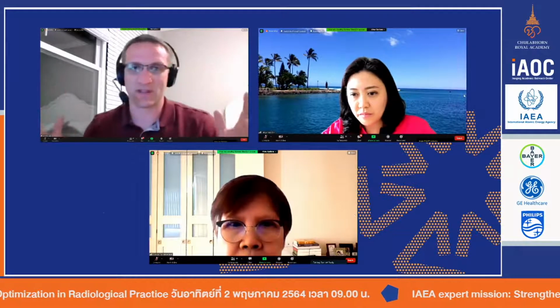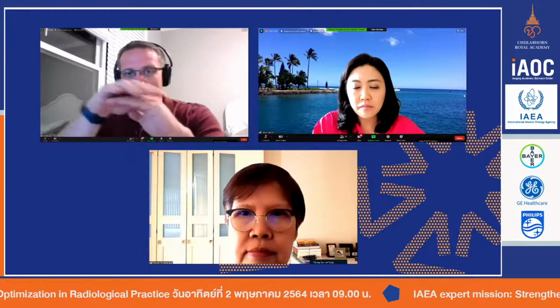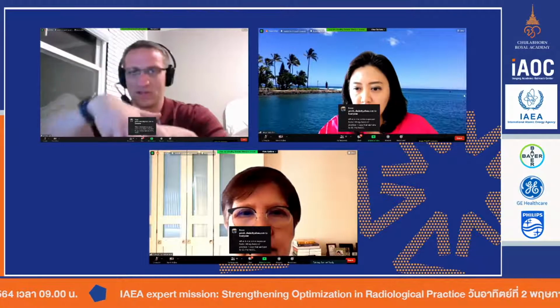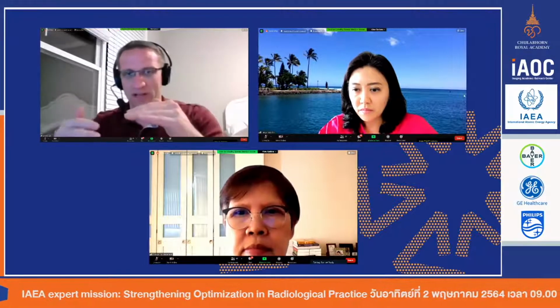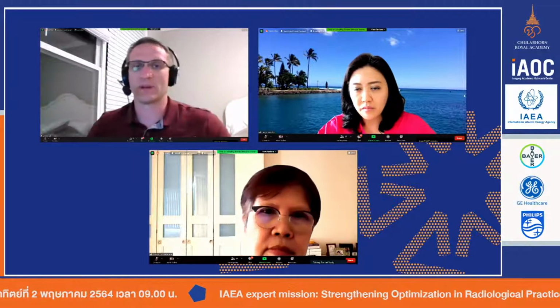For most patients, even for kids, you're going to use a grid. For the littlest, teeniest of patients, littlest of babies, you don't need to use a grid. That's just because there's not that much scatter. We'll talk about it next week about the radiation dose. When you put the grid in, you are immediately covering about 30% of the anatomy, so you have to increase the dose by about that much so that you can get more photons through. Therefore, if you put a grid in for a teeny little baby that doesn't cause a lot of scatter, all you've done is increase the dose to that baby. But for most people, from a 1-2-year-old on up, you're using a grid for everything: chest, abdomen, pelvis.